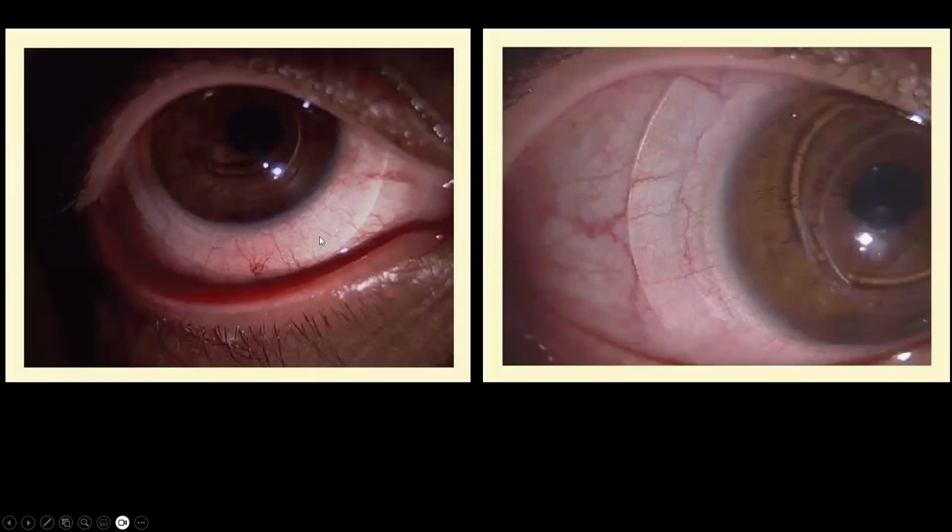So have a look at this. If you look closely at this, this is where the scleral contact lens is sitting, far from the limbus. I'm sure you can see it here. And if you see the second picture on the right, you see where the scleral contact lens is sitting. And the word sclera means it is on the sclera. That's as simple as that.